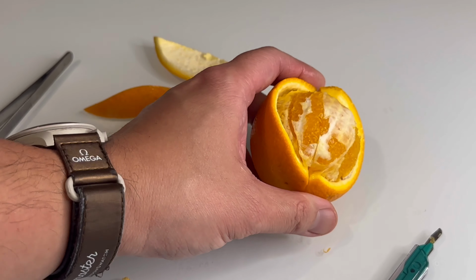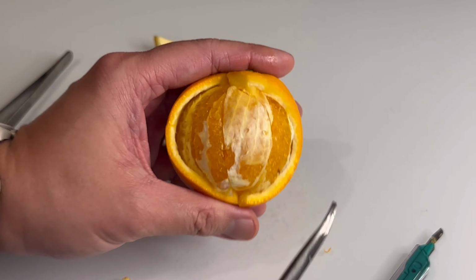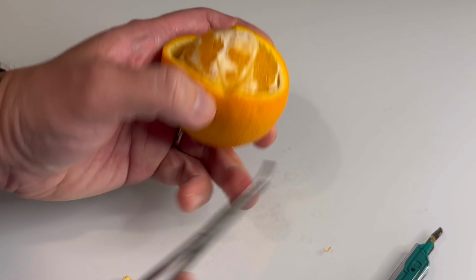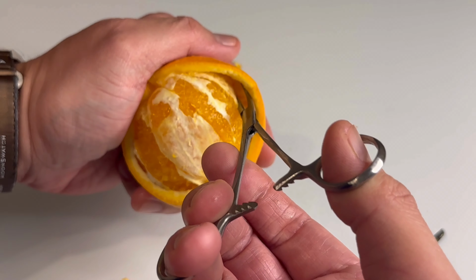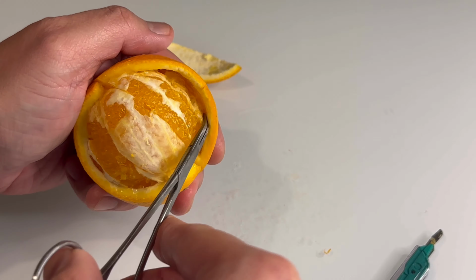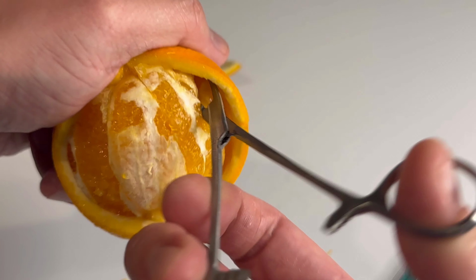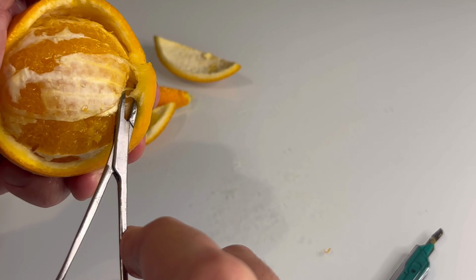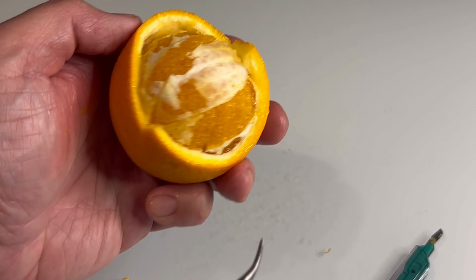Other things that you can actually utilize are actually spreading with tissue forceps or hemostats. If you're using a hemostat, you put it in here and then spread, and you can see tissue spread. There. You have to be following tissue planes to actually go in. So you can continue to do this and spread it. You can come look at that one. And it has to follow in one plane and not multiple planes.